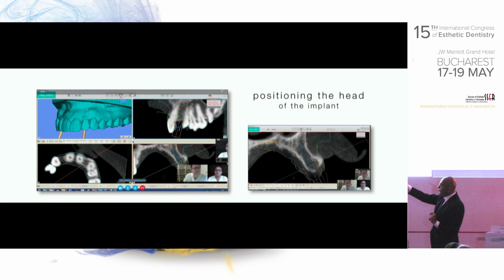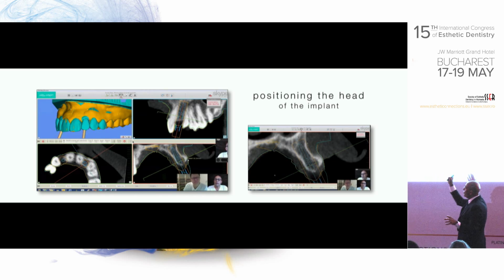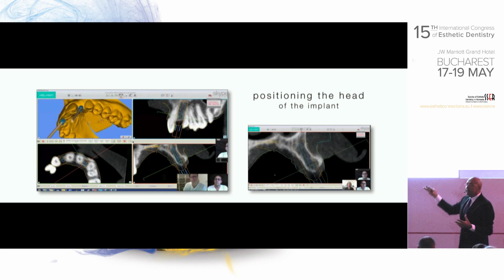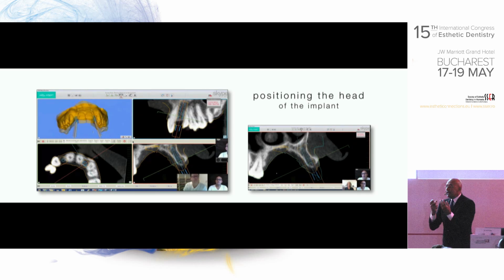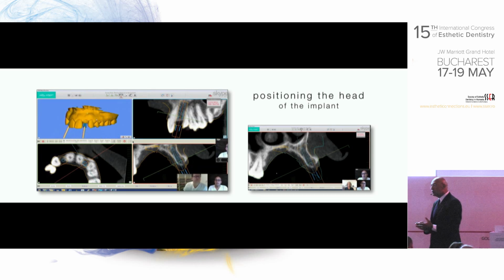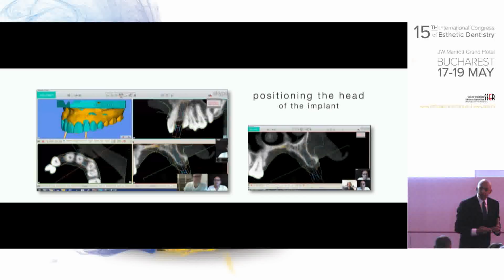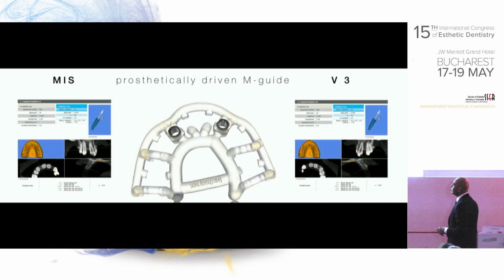The green refers to my mock-up, and with a touch, you can strip it off. You see the original, and this way, you decide. And in most of these sophisticated guide programs, it already tells you exactly which abutment you should use at the end of the treatment. So it's like living in heaven. The only thing you have to do is the perfect prosthetic setting before you get into these details.